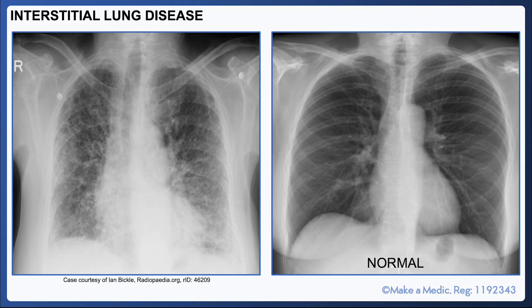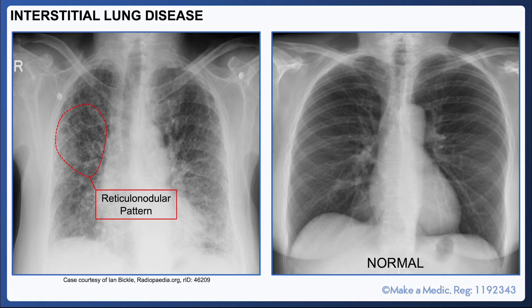Interstitial lung disease is a group of diseases characterized by scarring of the lung tissue. It classically gives rise to a reticulonodular appearance — a radiographic term that refers to a combination of looking nodular, i.e. the presence of small nodules, and looking reticular, i.e. looking like a net. The changes may be widespread or may predominantly affect a certain region.